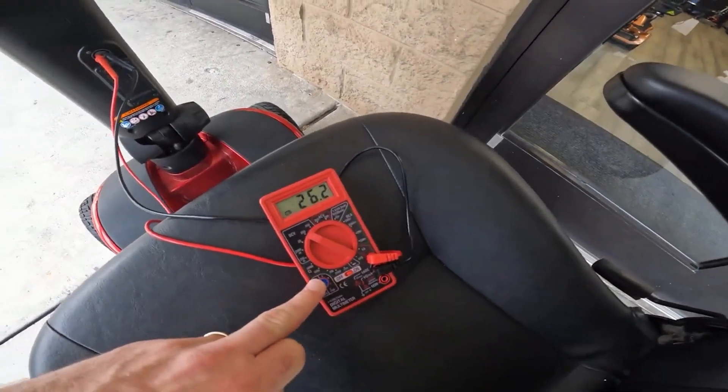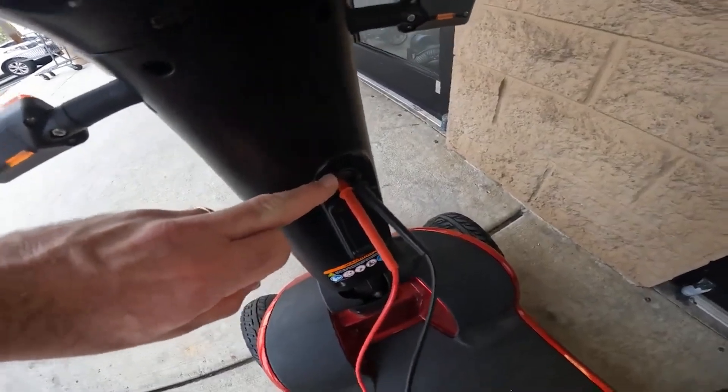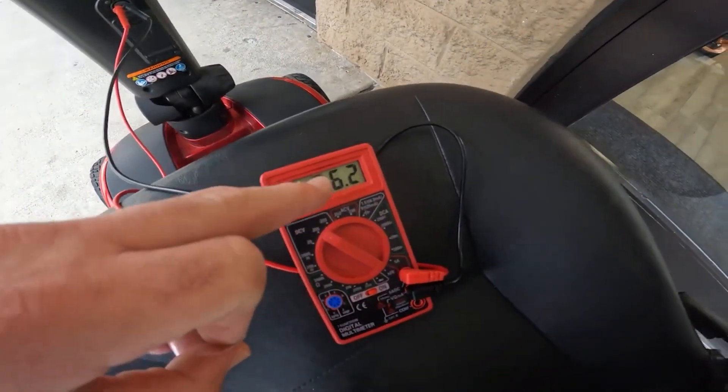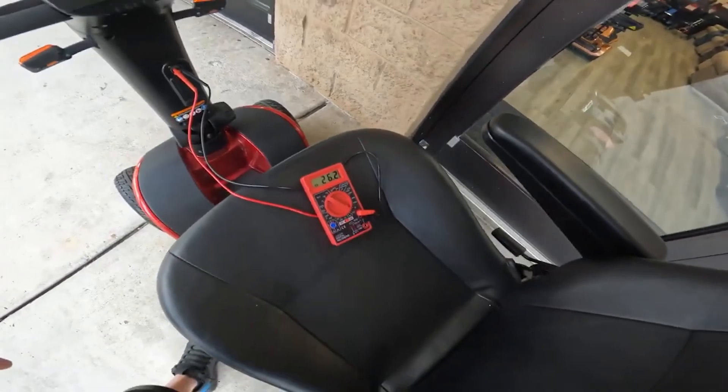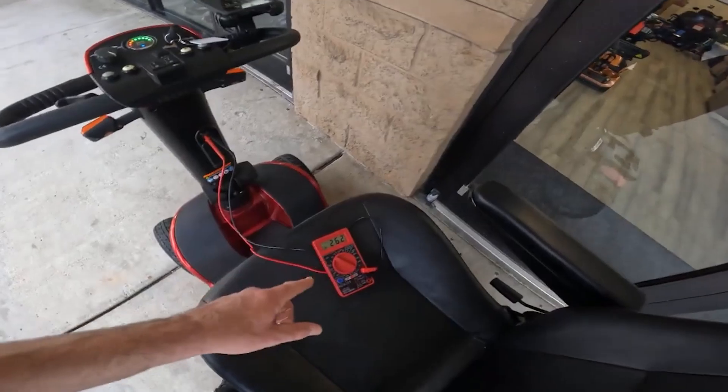Hello everybody and welcome to our YouTube channel. In today's video, we're going to show you how you can quickly and easily test your mobility scooter batteries without a technician. You will need a multimeter or a voltmeter, which is what you're seeing on the screen now, and the process is pretty straightforward.